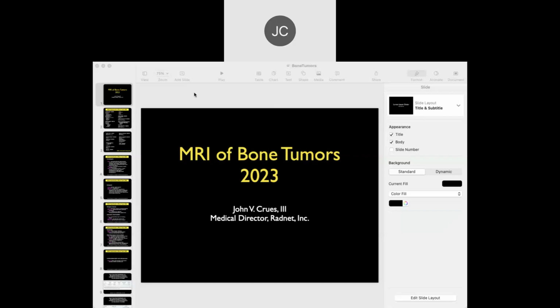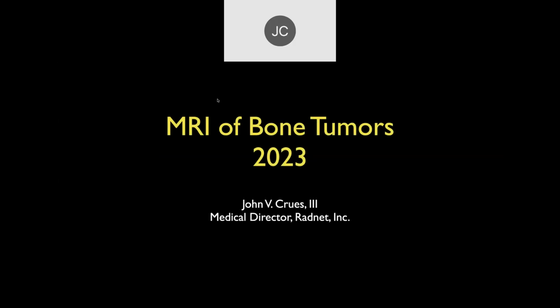Okay, so I'd like to go ahead and get started. I'd like to talk a little bit about the differences between previous lectures and bones. And then there's a recent article that I saw in the American College of Radiology journal, which talks about how to differentiate low and high risk findings on plain films concerning neoplastic disease.